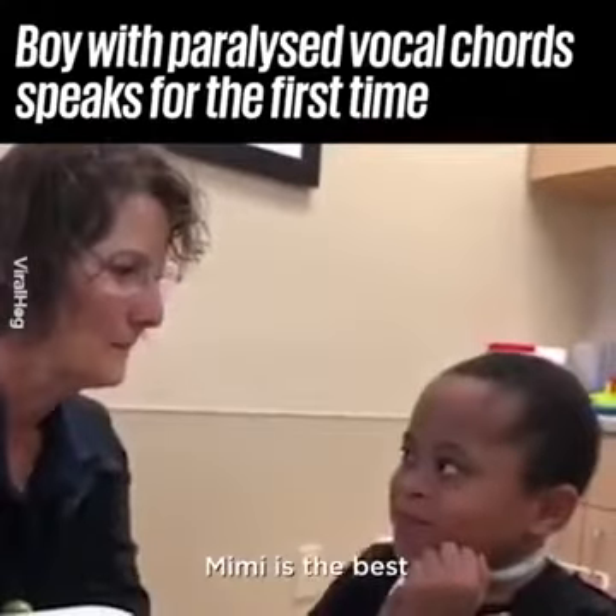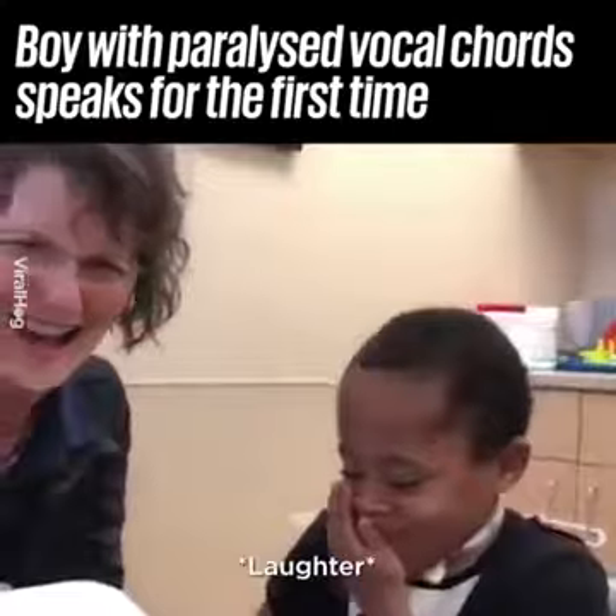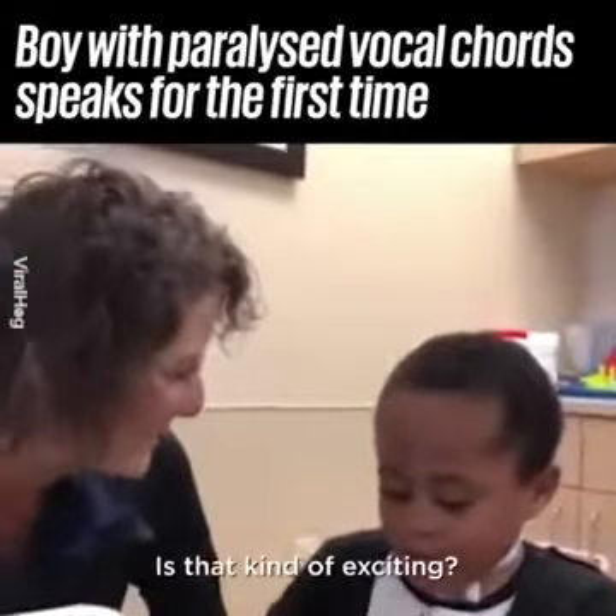There you go — okay, say something. 'Mimi is the best.' Is that kind of exciting?